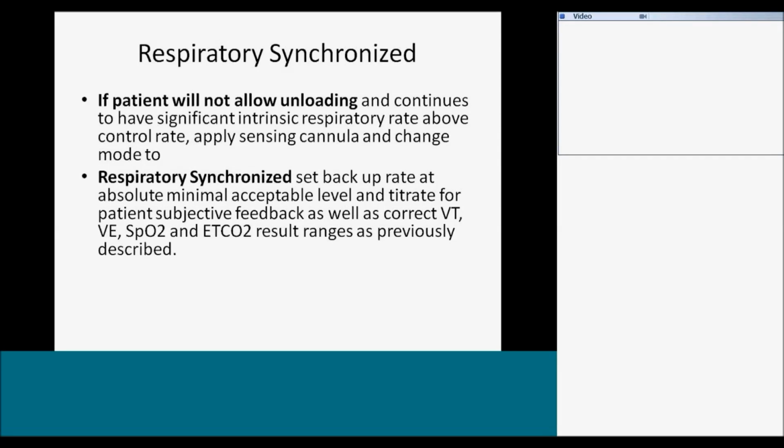So it may not be as advantageous for patients that we want to give full rest so they have more capabilities in between use of the device. But whatever works best for the patient is going to be what they're going to be most compliant with. And in respiratory synchronized, we want them to have one-to-one synchrony with the device. So for every respiratory effort that they make, we should have a cycle from the machine.